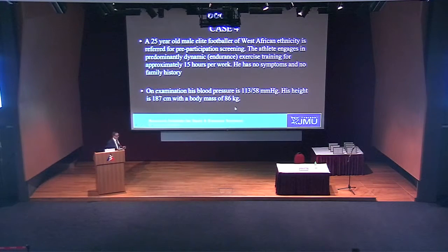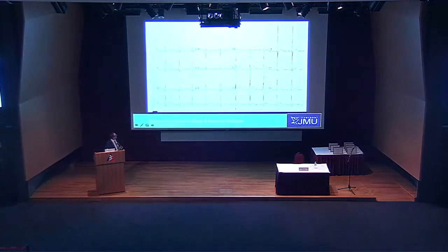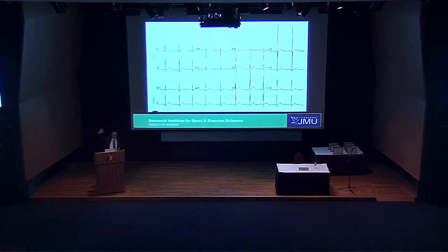Examination, blood pressure, completely normal. ECG, okay. Normal or abnormal? Hands for normal. Hands for abnormal. Okay. We think this is normal, okay? We think this is normal. We don't see anything wrong with this.